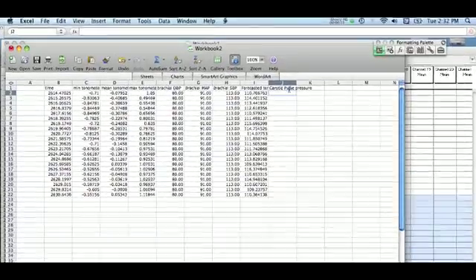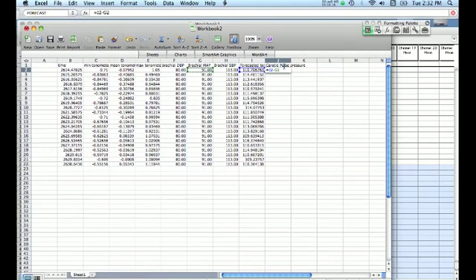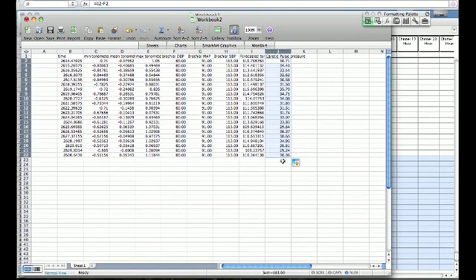From this particular parameter, you can then determine carotid pulse pressure using the simple formula of this particular value minus diastolic in the brachial, which you assumed was the same in all arteries. So you end up with a value for pulse pressure for every single beat. You can take the average of this if you like. For the sequence of beats, the average pulse pressure was 32 millimeters of mercury.